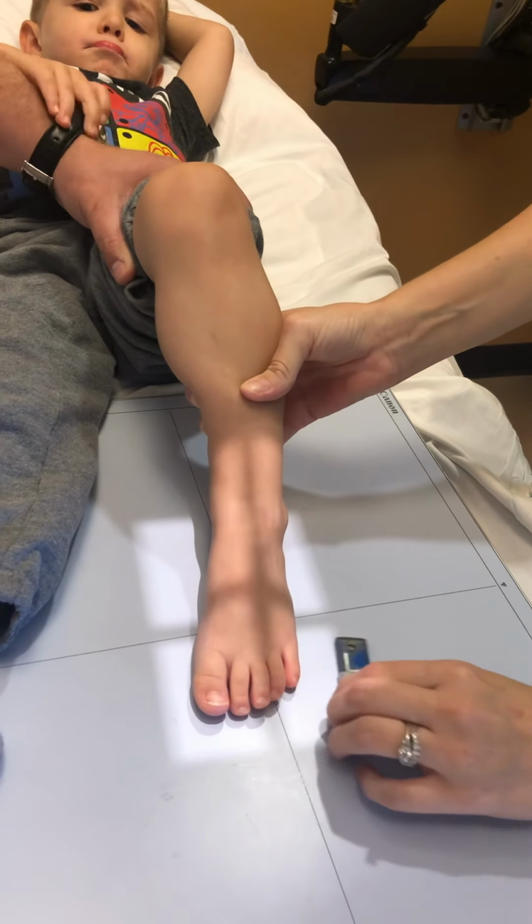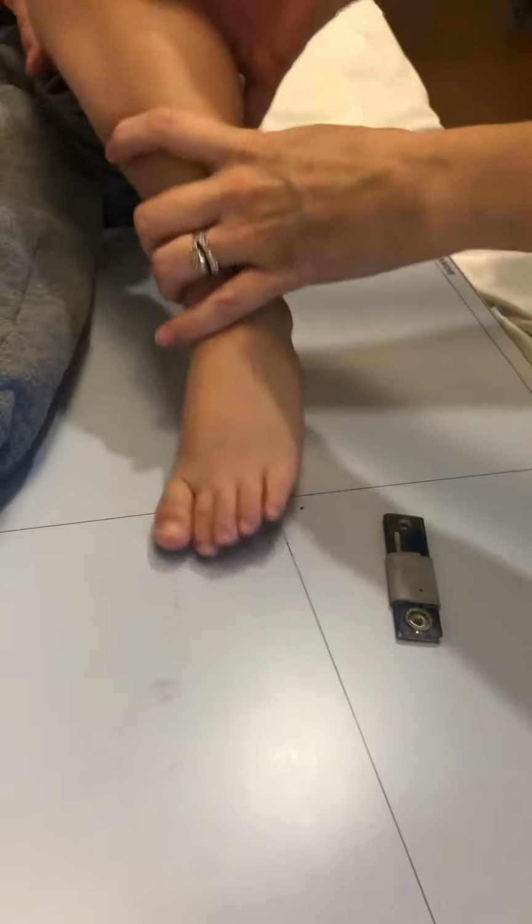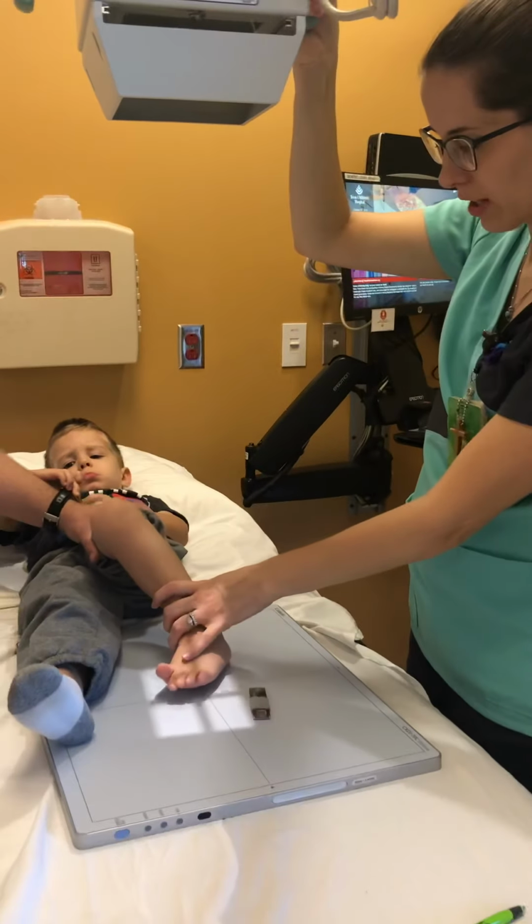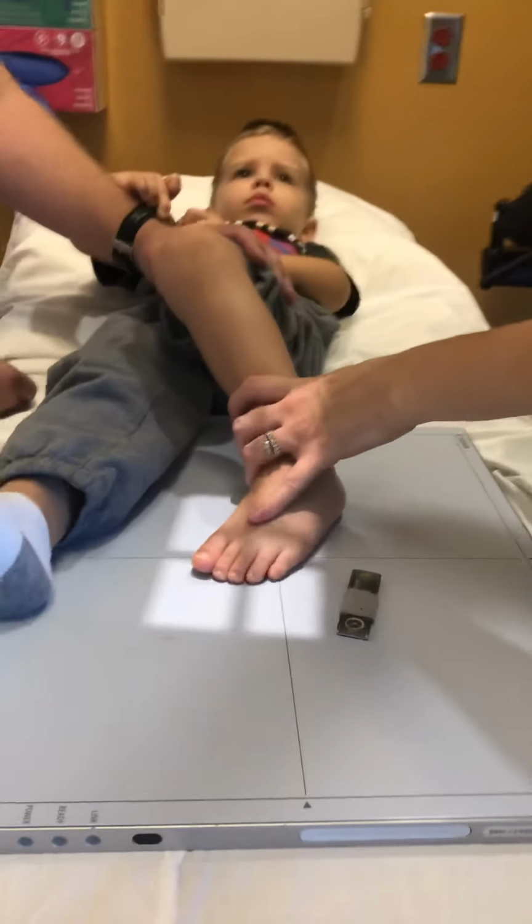Okay, so AP. The oblique, same thing, although we are going to just collimate down to the toes themselves. Relax your foot, baby. There you go. Good job.